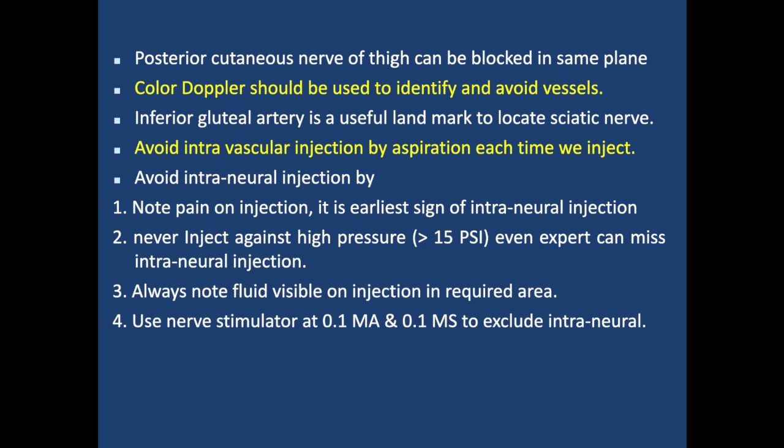Even an expert can miss intraneural injection, and the incidence of intraneural injection is very high. We always note local anesthetic solution visible on injection in the required area. We use a nerve stimulator at 0.1 milliampere and 0.1 millisecond to exclude intraneural injection. Thank you.